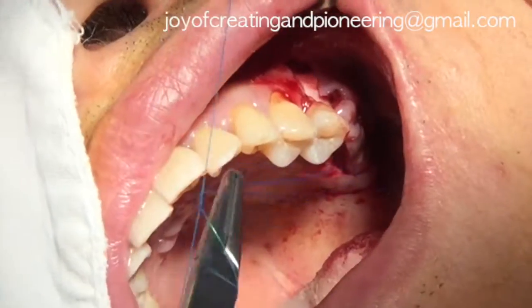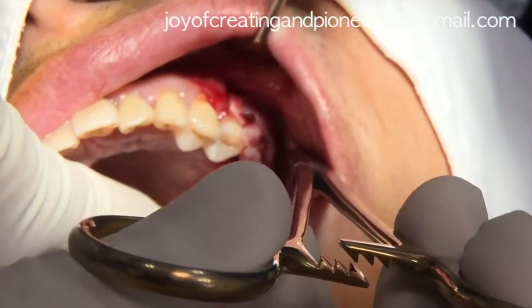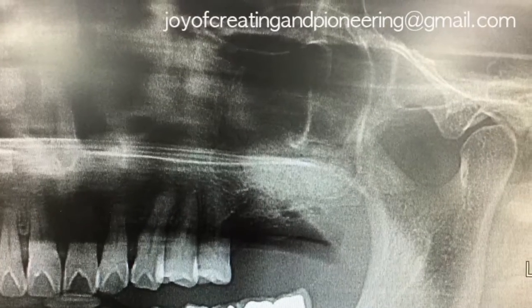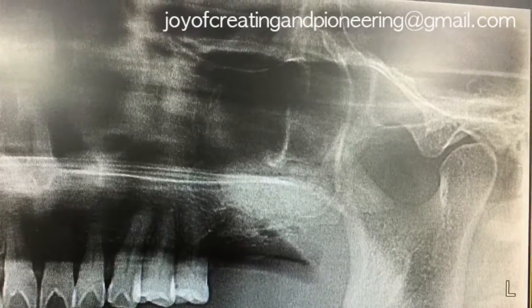Interrupted and modified mattress sutures were performed and finally the tension-free primary closure was obtained. The radiograph after the surgery shows the well-placed graft materials inside the sinus and also on the crestal area.